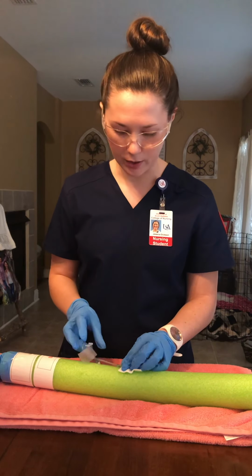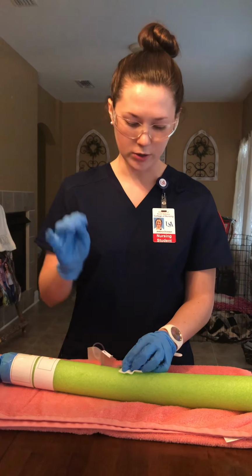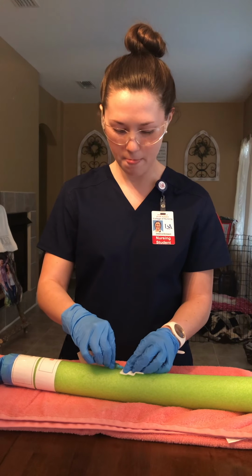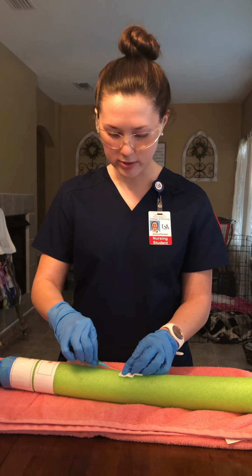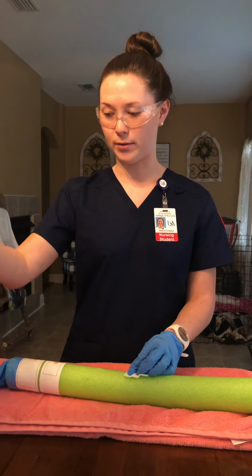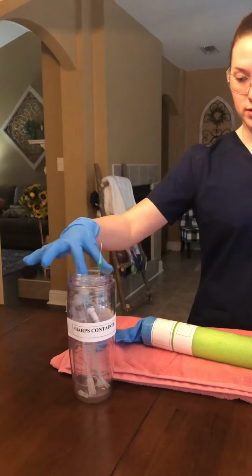Alright, and to pull this out, I would need to use my dominant hand, and I would need to keep it parallel to the vein and remove slowly. Once it is out, I'm going to inspect the catheter for intactness, and then I'm going to dispose of that.